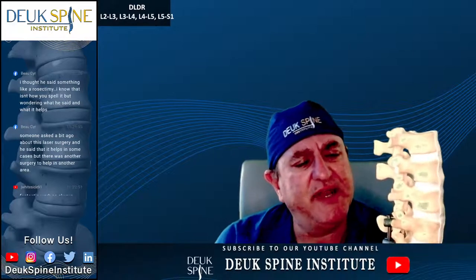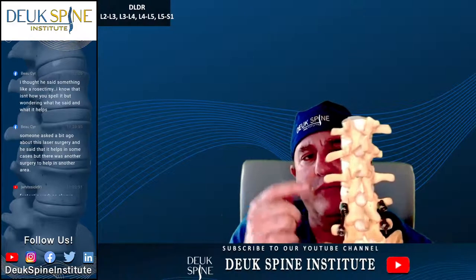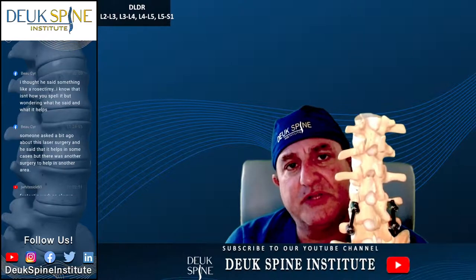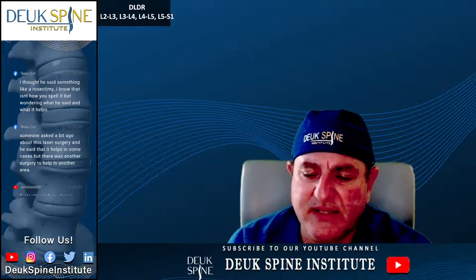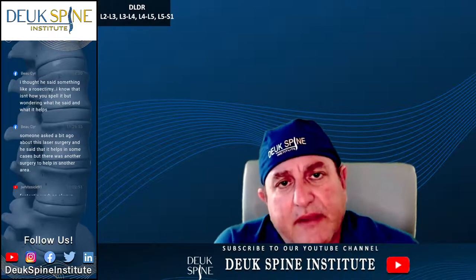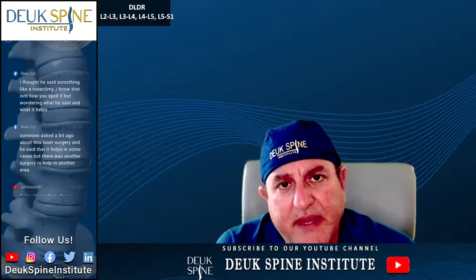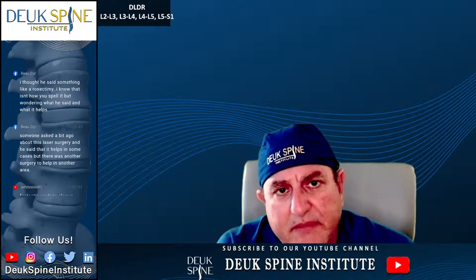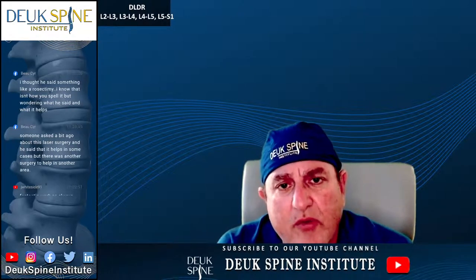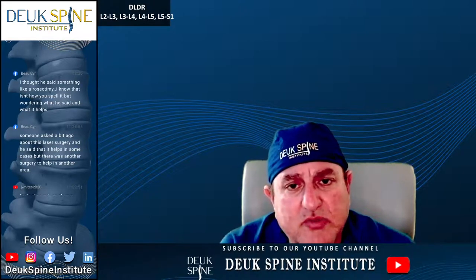So this patient had four disc herniations with annular tears on the left side. We went in on each one, cleaned up the tears and the herniations, and unpinched the nerves. So I expect his left leg pain to be gone, and I expect his left leg neurogenic claudication to be gone. That's where you stand up and walk and you start getting an aching pain in your leg. You may get weakness, numbness in the leg as well. All of that's due to the nerves being pinched as they exit the neuroforamen. I also expect his back pain to be gone from L2 to S1.